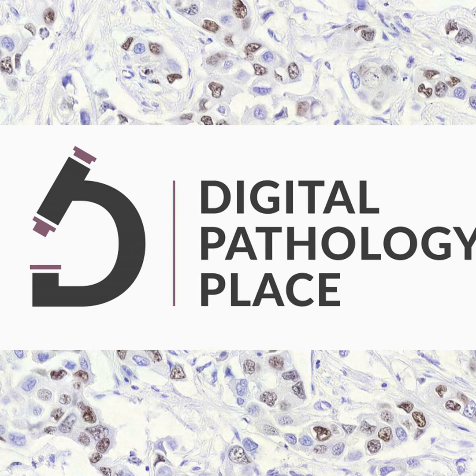Then in 1995, the AFIP embraced the future by starting a telepathology consult service primarily using static images. This represented an important endorsement of the technology from a prestigious institution.